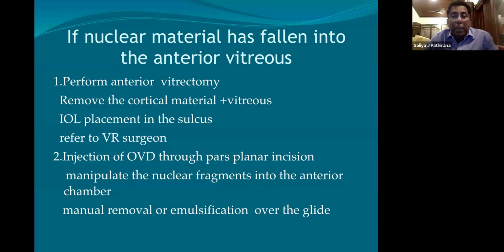Of course, some people suggest to go through the pars plana and inject some OVD and try to get the lens matter into the AC. But I don't advise doing that. Some experts advise this.